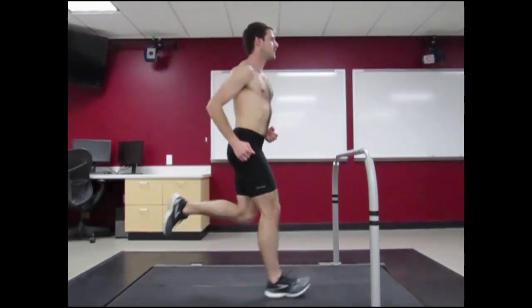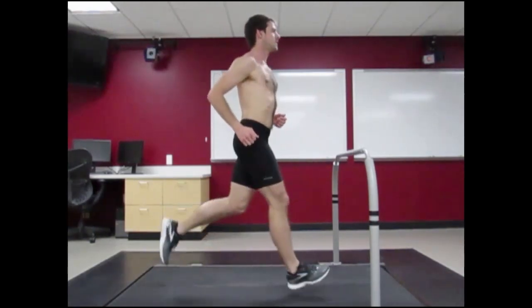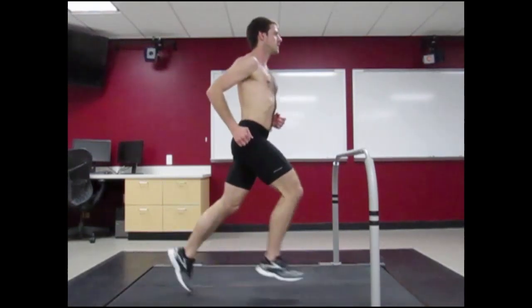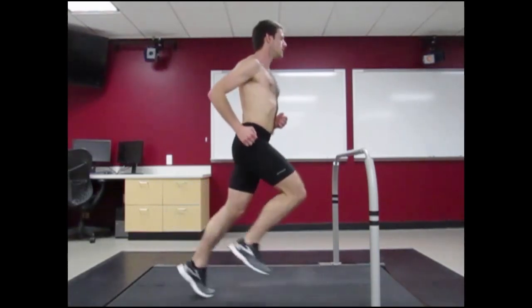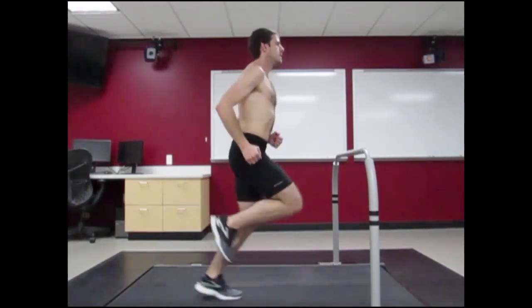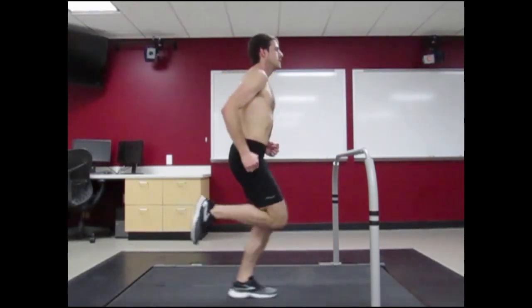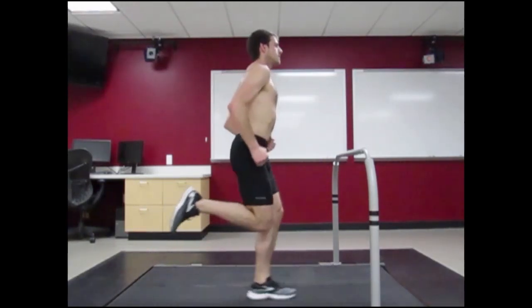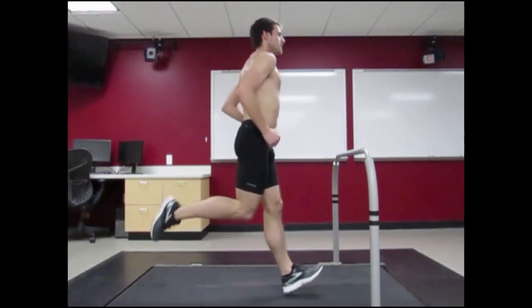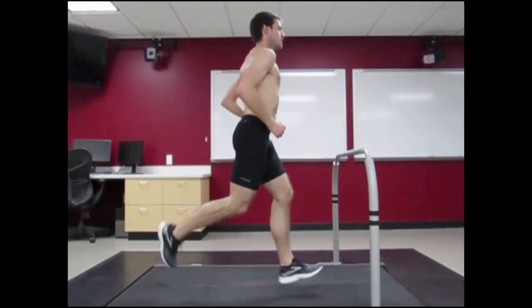This becomes much easier when we're able to slow the video down. Now, to be able to do this without getting a lot of blurring that can sometimes happen with video recordings, it's important to use a high-speed camera for running motions or other sporting type movements. This camera and this recording was done at 120 frames per second. Most video cameras record at only 30 frames per second, so this gives us 4 times as many frames to be able to assess the body's posture with very little blur being present.